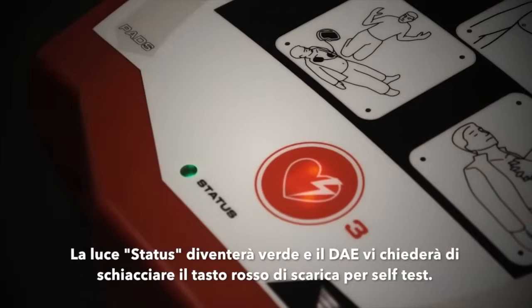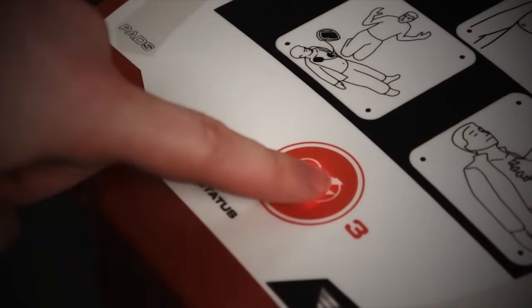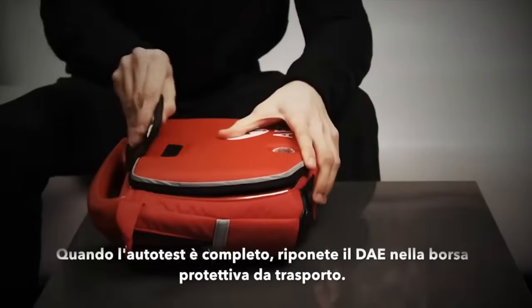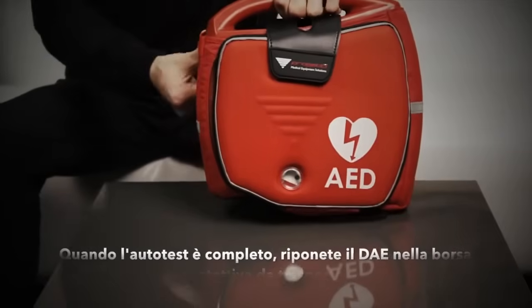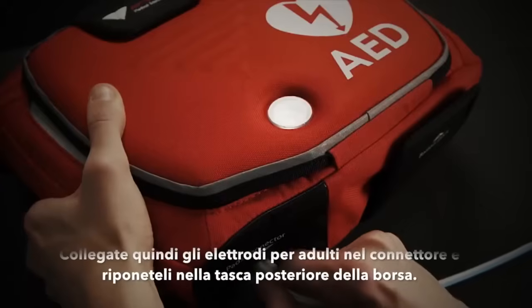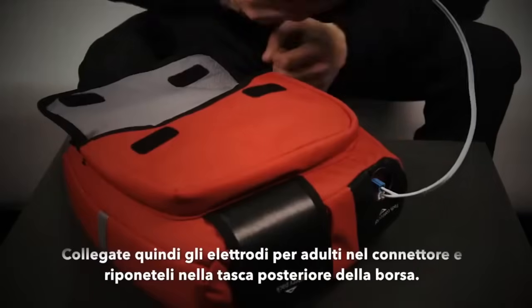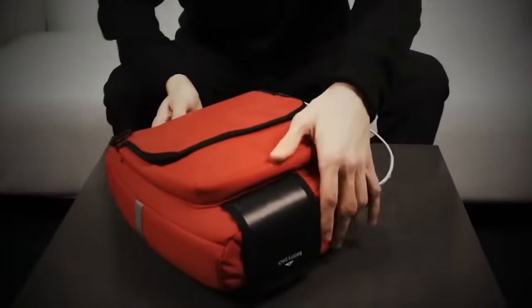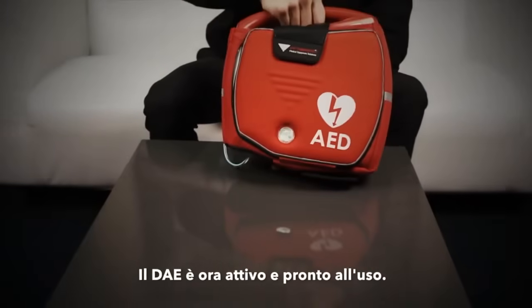Self test — press the red shock button. After the test is complete, slot the defibrillator into the protective bag. Connect the adult pads and slot this into the accessory pouch.